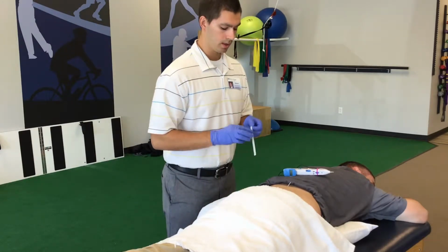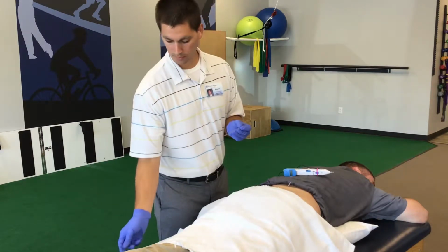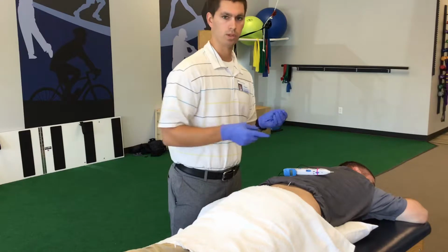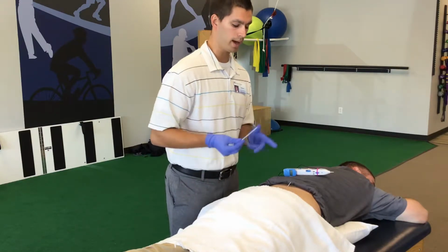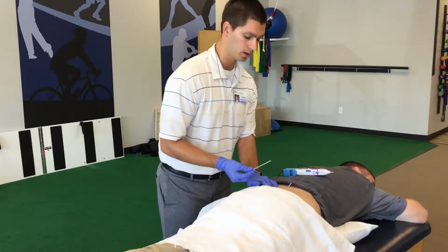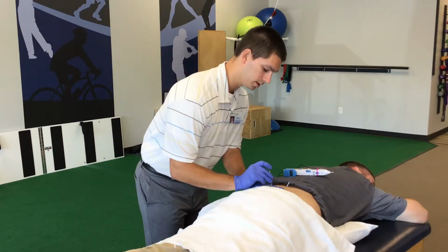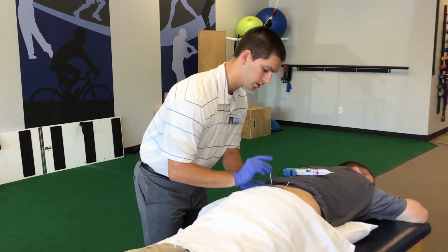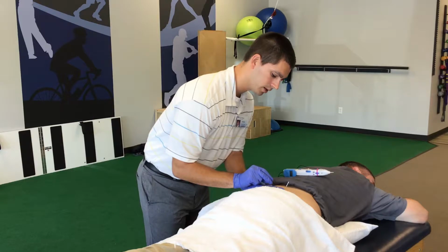And so that's the one side. For the purpose of the video, we would normally switch sides, but just for me being in the way, I'm not going to do that. And so we're just going to go here. And so it'll be a little bit different. Same thing, Josh, let me know if you have any weird, funky feelings. Dull, crampy, achy is normal.